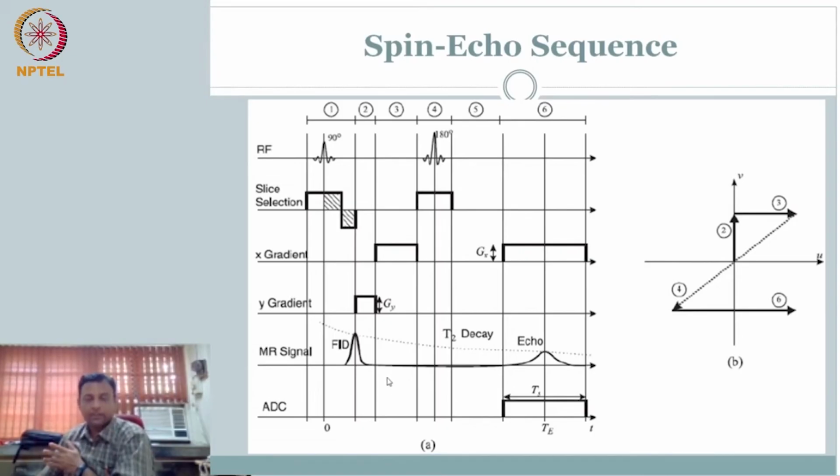If I was just recording the signal, then this is good enough. With phase encoding and frequency encoding, I would have recorded the signal. But this is not what I want. Now I am applying a 180-degree pulse. It starts to dephase, and quickly thereafter I am applying a 180-degree pulse. What this 180-degree pulse does is it groups the signal together.